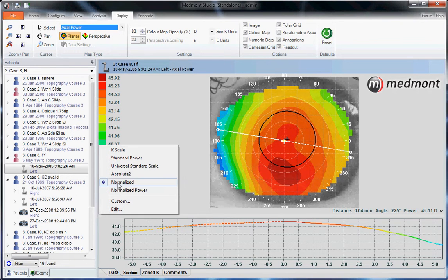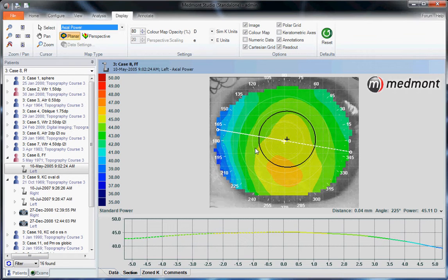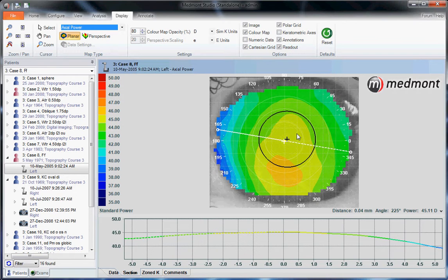We might choose a different scale for this particular case — either a K scale, a standard power, or universal scale. Any one of these scales might tell us whether the eye falls completely within the red, at the steepest end of the scale, or conversely, if this were a post-LASIK patient, whether the vast majority of powers fall within the blue. If the patient has green-yellow contours, it's most likely a normal curvature. Red indicates the steepest end of curvature; blue indicates the flattest end.